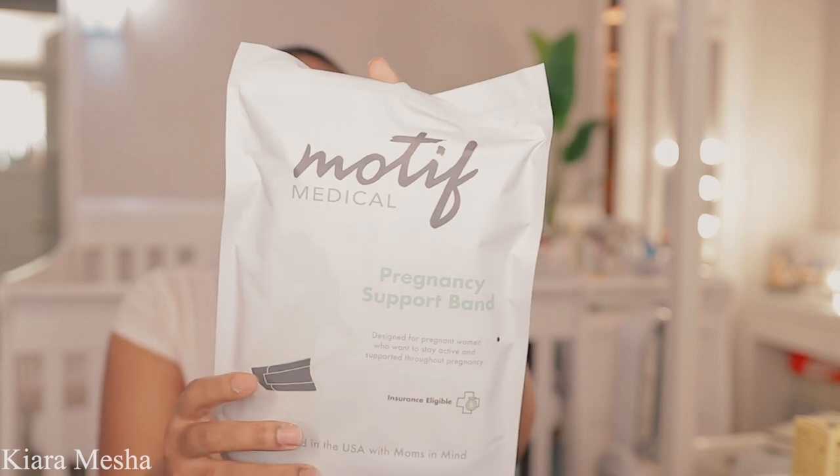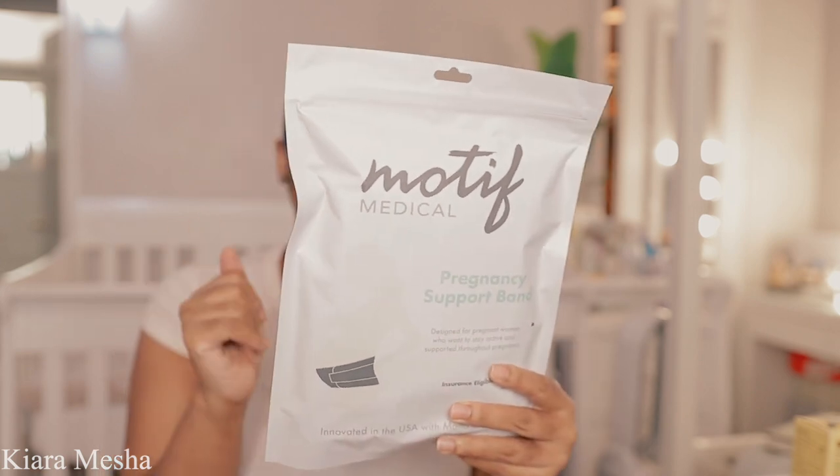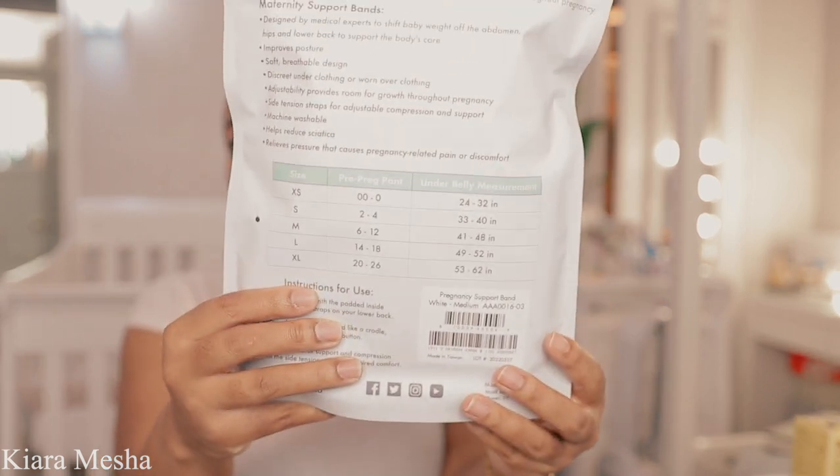At one point my doctor didn't sign off on the prescription so I ended up buying one — wasting money. But I'm gonna open it. These are also by Motif Medical. I have it in a size medium. The sizing is based on your pre-pregnancy pants size — not your pregnancy pants — and the medium is good for a size 6 through 12. I'm just gonna open this because I'm wearing this one today.